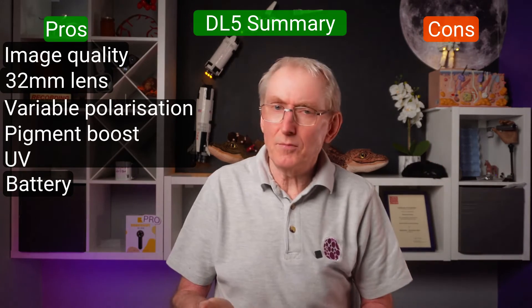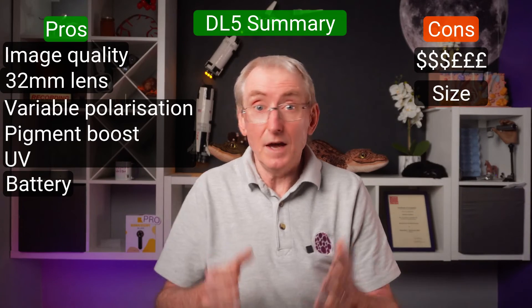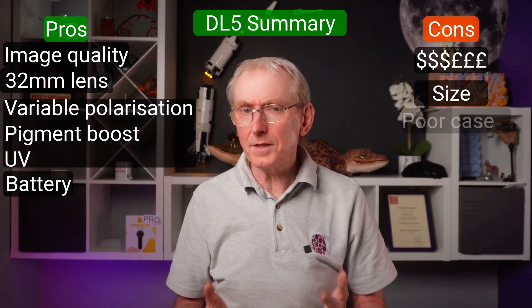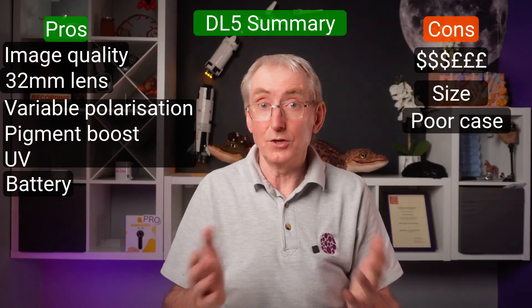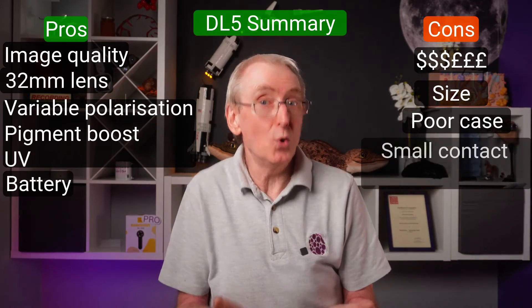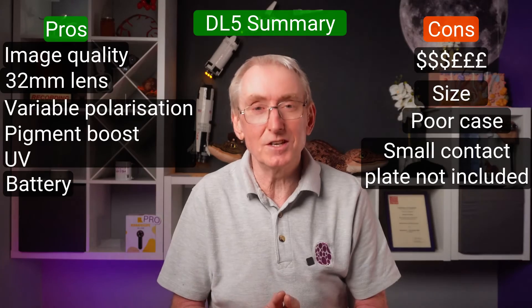Cons: It comes at a premium price — can you afford it? It's larger and heavier than any other dermascope, and if you have small hands and a weak grip, perhaps try one first to see if you could enjoy it long term. I think the leather case is weak for protecting your investment, certainly for a busy GP bag filled with other essential items. The trade-off for the wide 32mm lens is the reduced ability to access awkward places, and without the optional small contact plate you will struggle at times.